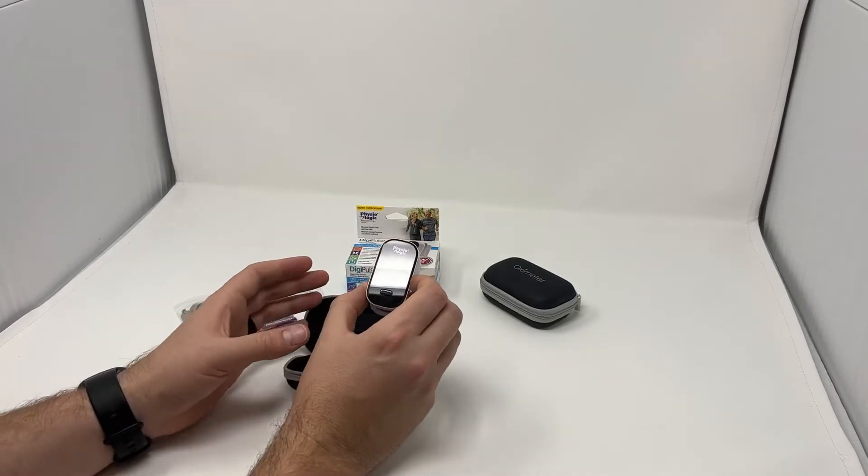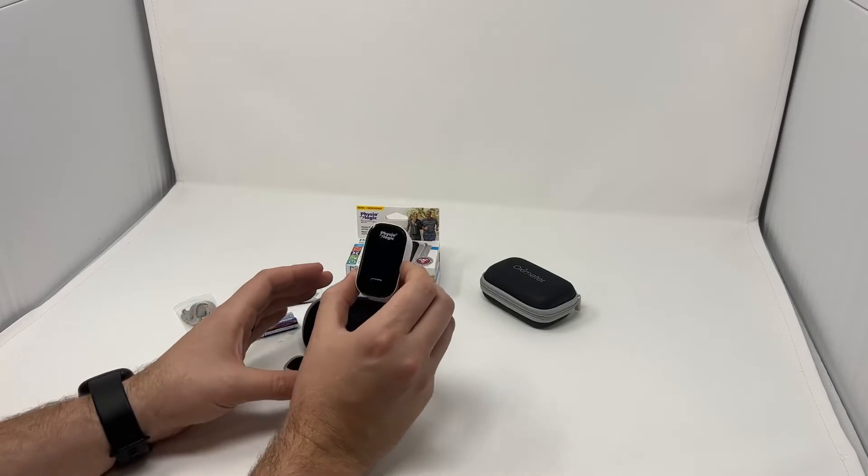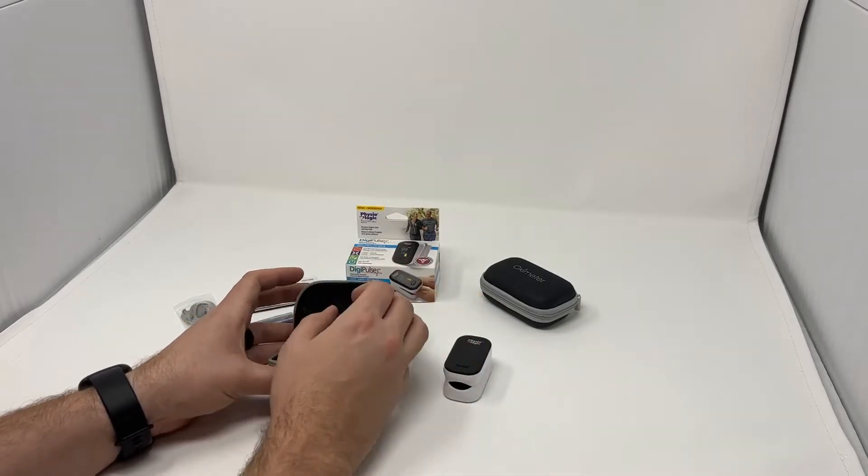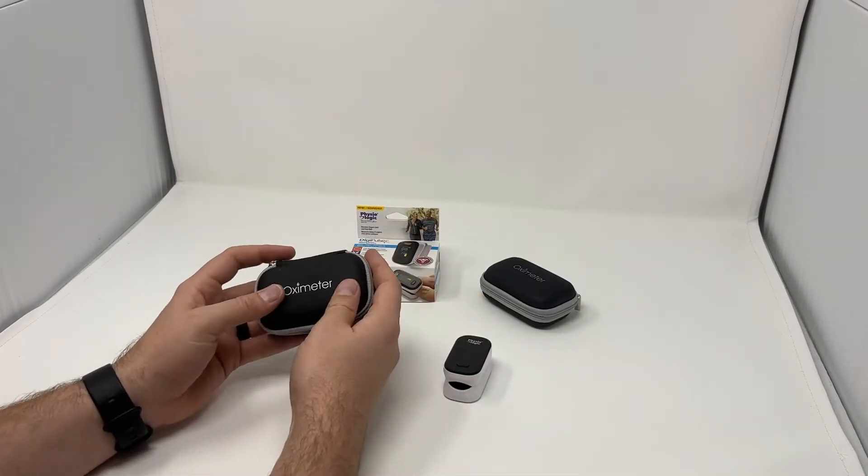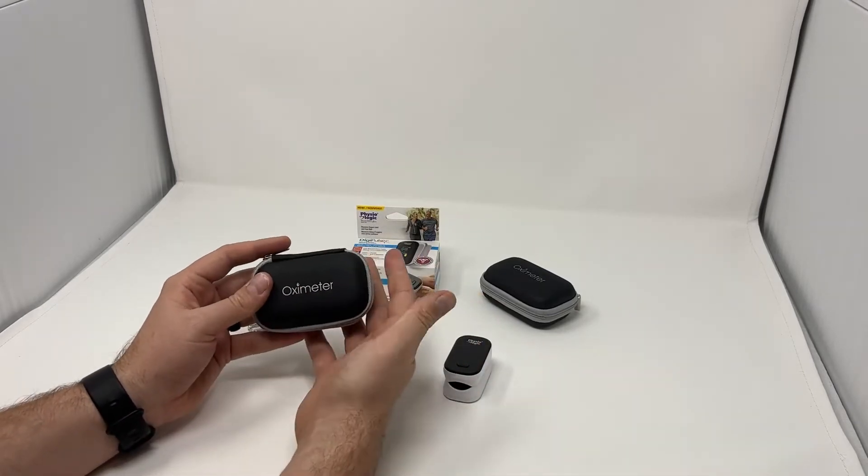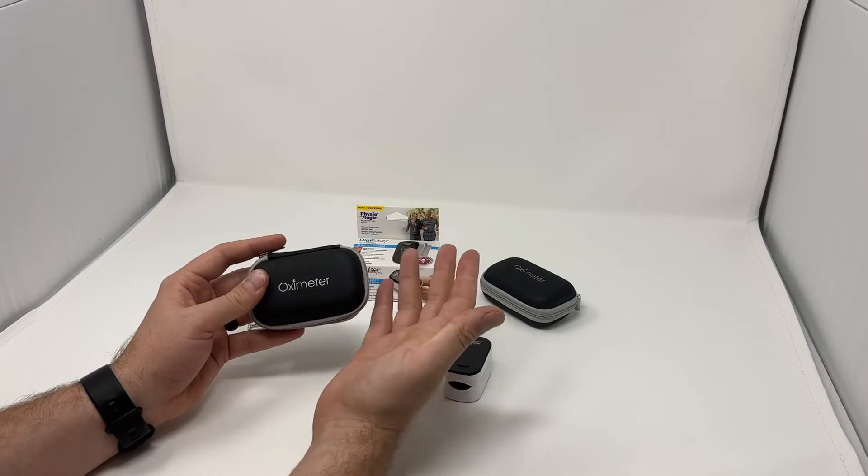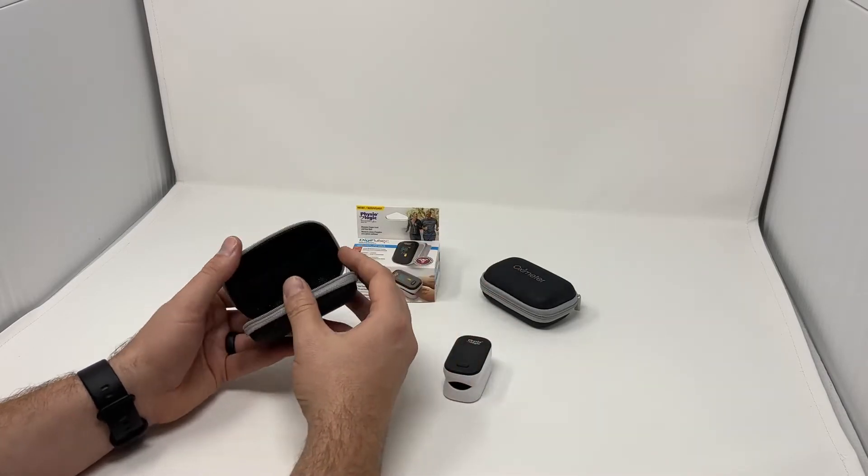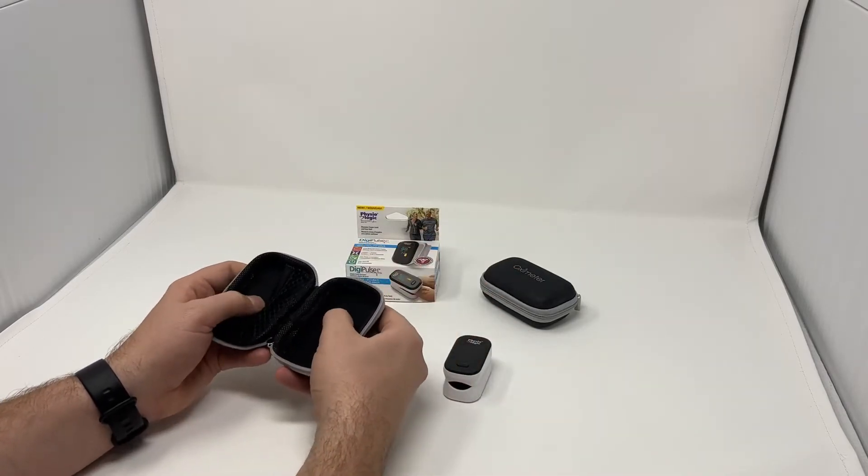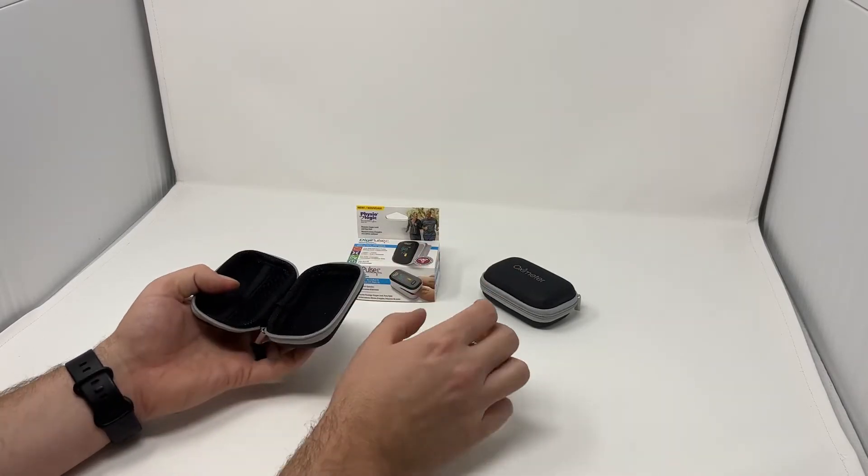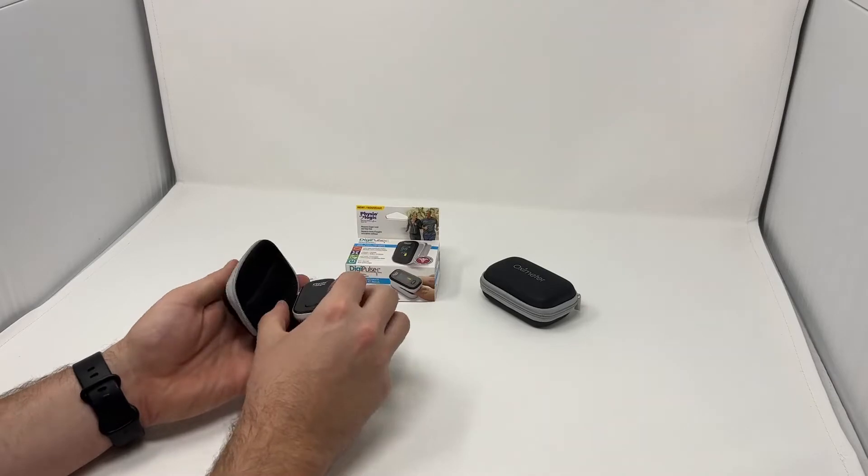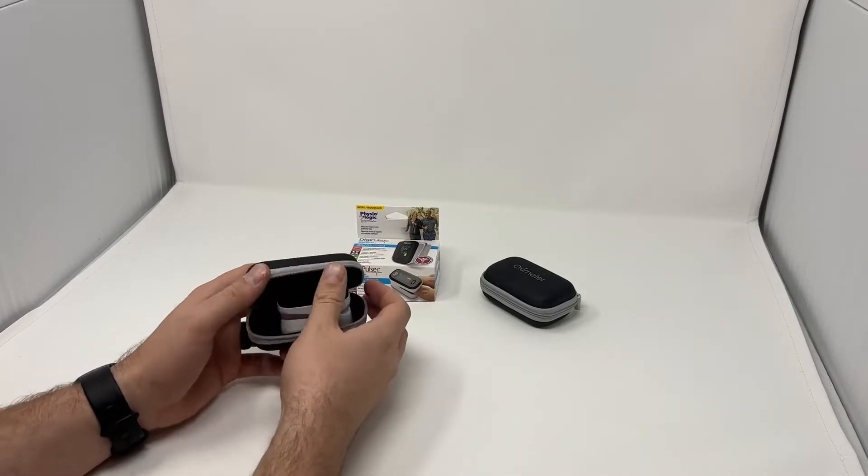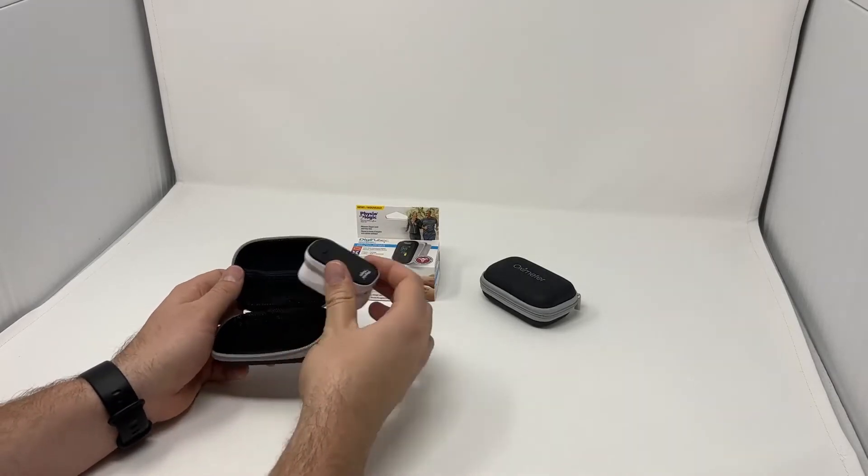We're also going to include with all of our pulse oximeters this oximeter case. It actually says oximeter right on it for ease of knowing what's in here. It's a really high quality hard padded case that's going to protect your pulse oximeter and it has space for accessories.